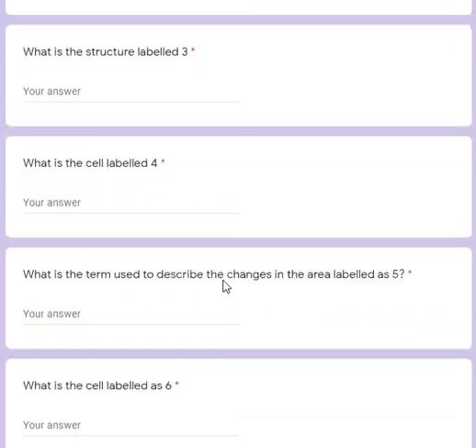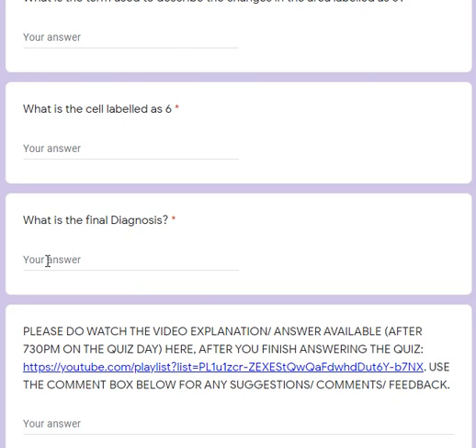Okay, so the final diagnosis, Hansen's disease. If you've said tuberculoid Hansen's, then for borderline tuberculoid, actually you get 10% marks. Any other answer in the tuberculoid spectrum, also in the Hansen spectrum, you can still give yourself full marks.